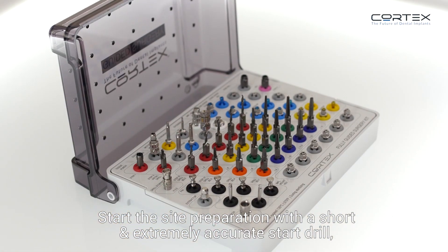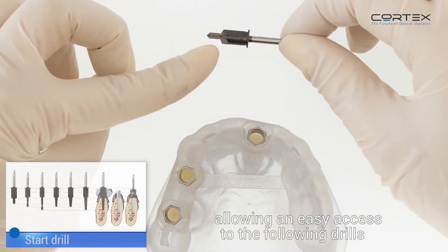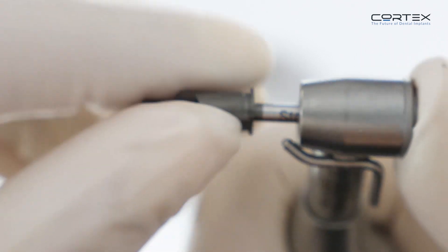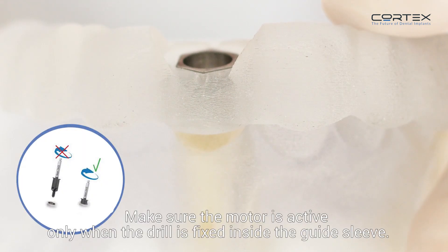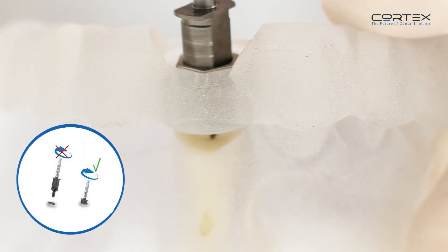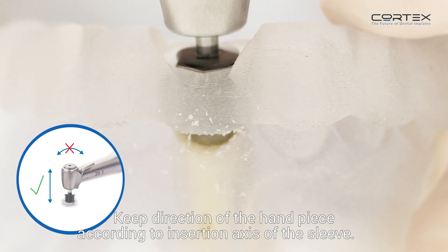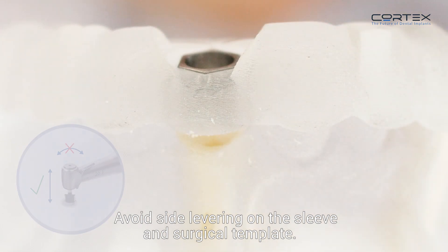Start site preparation with a short and extremely accurate start drill, with a built-in bone profiler allowing easy access to the following drills and creating the optimal emergence profile — perfect for intra-bony implants. Make sure the motor is active only when the drill is fixed inside the guide sleeve. Keep the direction of the handpiece according to the insertion access of the sleeve, and avoid side levering on the sleeve and surgical template.